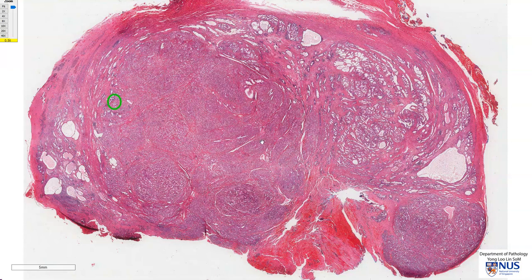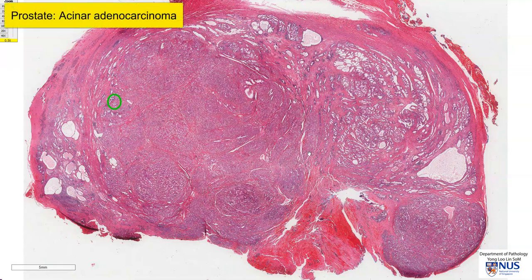This is a virtual microscopy slide of a case of prostatic adenocarcinoma, and the type of adenocarcinoma here is the commonest type, which is acinar adenocarcinoma.